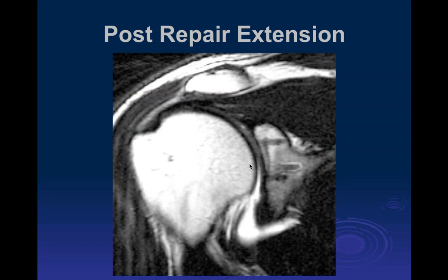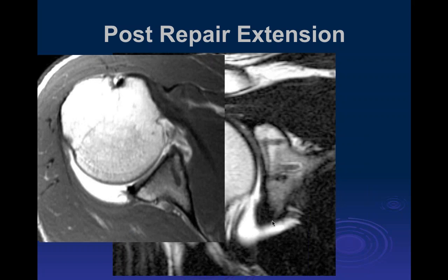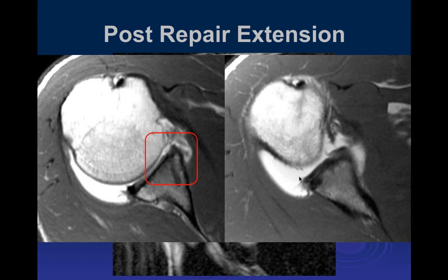Yeah. So here is another post-repair. Here we can see more of a superior suture anchor in this particular case. If we go to the axial images, again, we don't see a good labrum in the area where the repair occurs. And if we look carefully more inferiorly, we can see that there is a tear inferior in the labrum, inferiorly here, and at recurrent surgery, there was a tear of the labrum here, and they said the labrum was intact here, but it was atrophic.